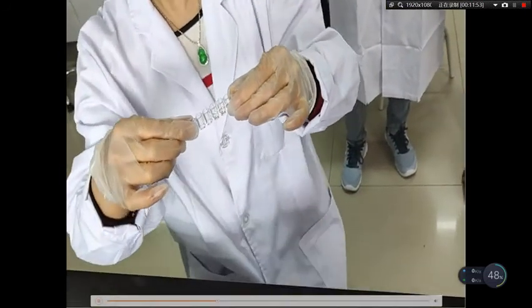And we can see there is no enzyme labeled antibody in the blank vials.